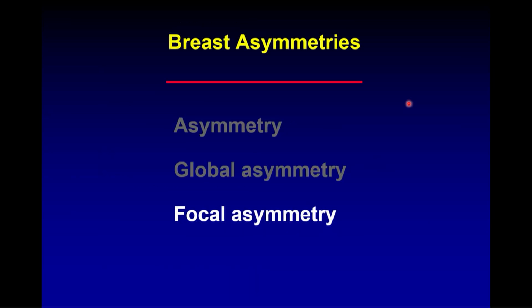Now, focal asymmetry is where it gets complicated. And focal asymmetry is not that uncommon.